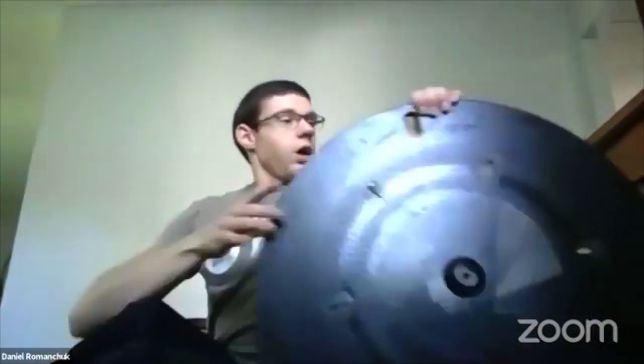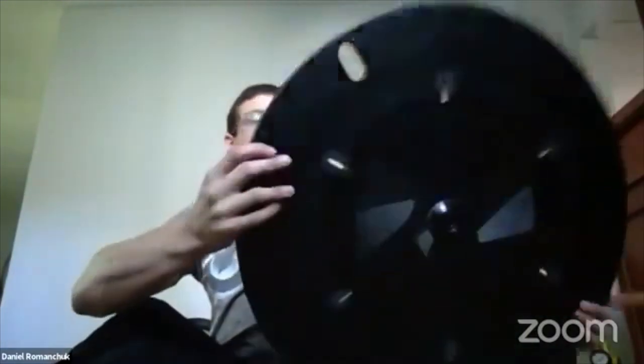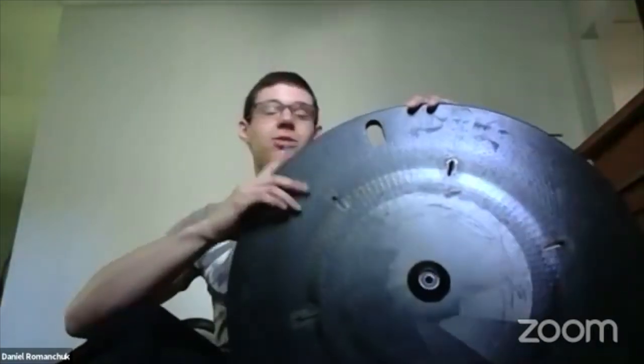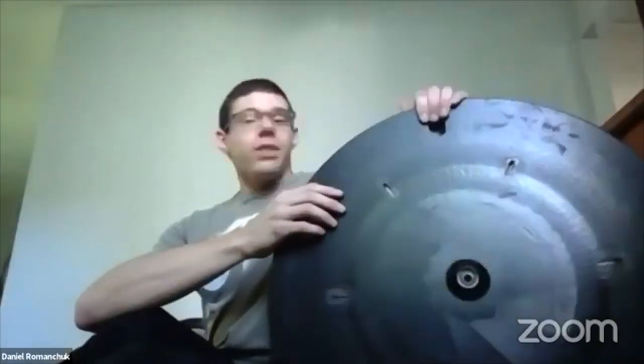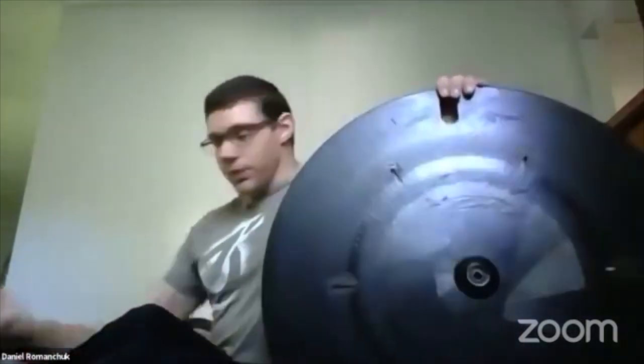Once you have the tire off, inspect the rim all the way around the wheel — especially if a large impact caused the flat, such as going over a rock or into a ditch. Always inspect the rim to make sure there's no structural damage. After that, it's time to get a new tire and put it on.